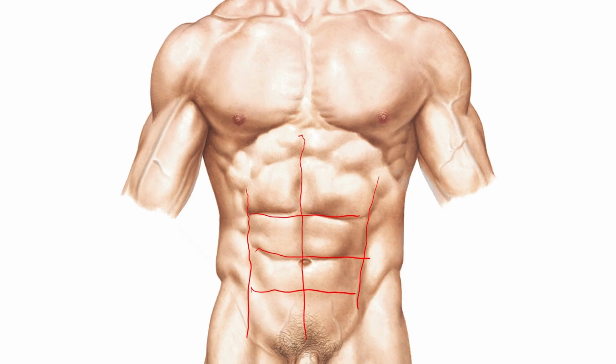The last landmark I want to address is a point found right here. It's called Palmer's point. This is a landmark utilized when accessing the abdomen with a Veress needle, which I'll cover in a little bit. Palmer's point is along the midclavicular line right here and is approximately 3 centimeters below the subcostal margin.